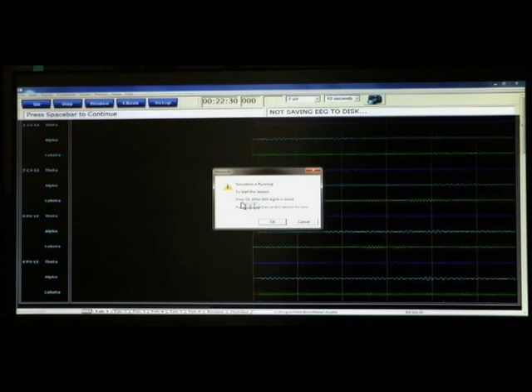Replace EEG cap. That's because I happen to be using Discovery, but it would be electrodes for your Atlantis users. I hit OK. It asks me, initializing Z-score training, the age of the client, whether their eyes are open, and the sites that we have selected: C3, C4, P3, P4. Making sure, again, you don't want to go real fast through these screens. It's important that this information is correct. So I hit yes. It then tells me simulation is running.